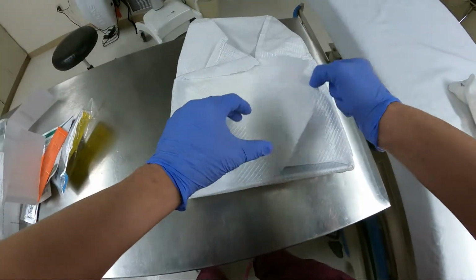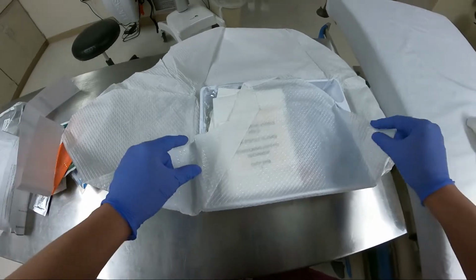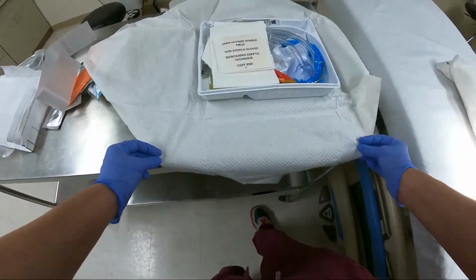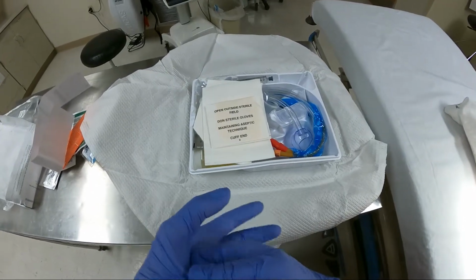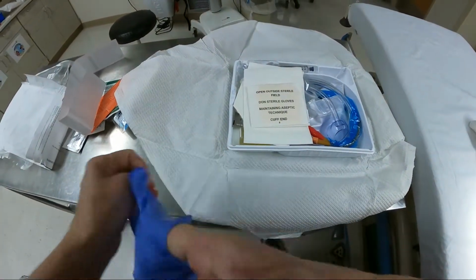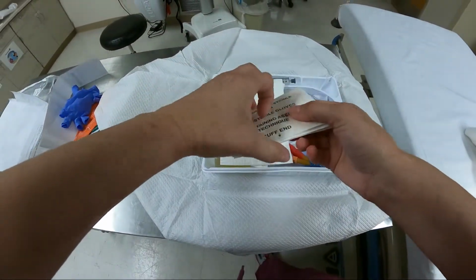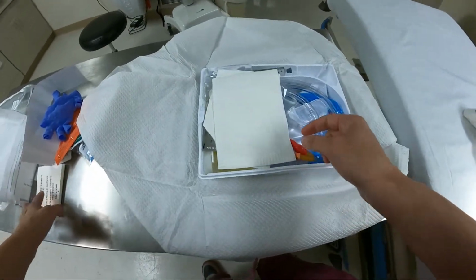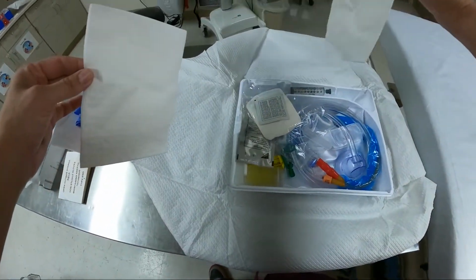And you're going to open up. At this point you can have gloves off, but I'm going to keep these on for a minute. Then when you open that up, that's what your kit's going to look like. I'm not going to put the sterile gloves on, but we're going to pretend I did. So you would put on the gloves, maintaining sterility. You've got these drapes.